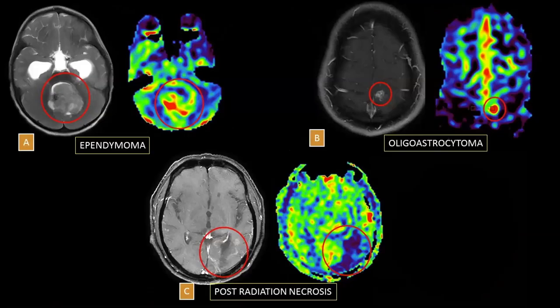A few more examples: this is a case of ependymoma showing patchy hyperperfusion — this is the area that should be biopsied to get the highest grade on histopathology and avoid sampling bias. A small oligoastrocytoma showing hyperperfusion. In a post-treatment follow-up patient with a small area of peripheral enhancement and irregular margins, ASL shows the area is completely hypoperfused — consistent with post-radiation necrosis with no obvious residual tumor.